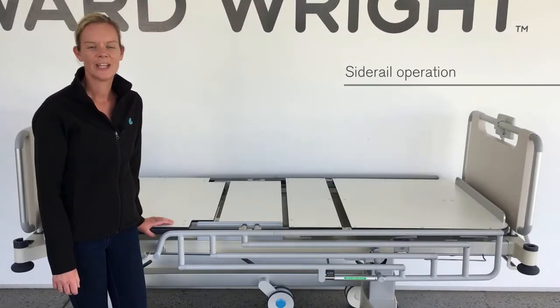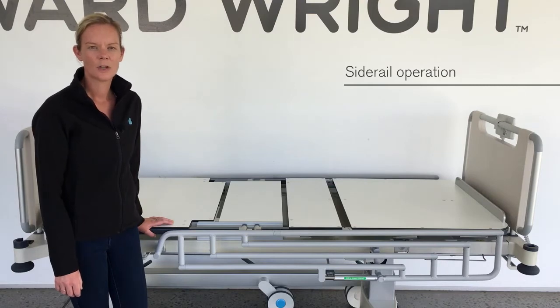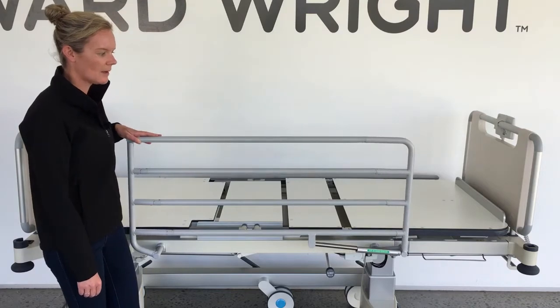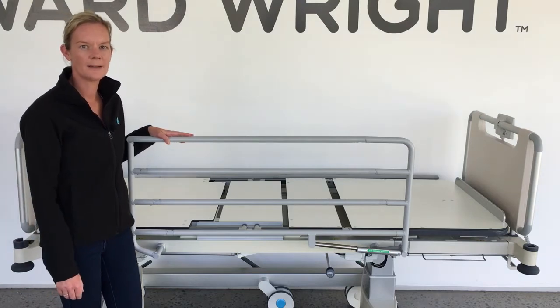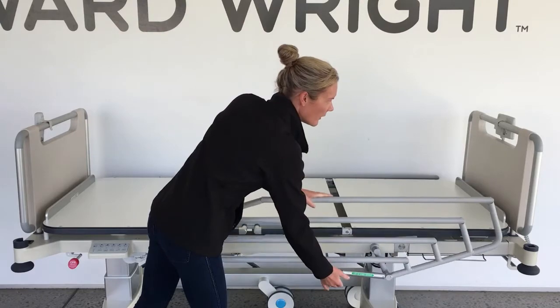Side rails are fitted to each side of the bed. To raise the side rail, simply hold the top rail and raise. The lever will automatically latch. To lower the side rail, hold the top rail with one hand, lift the release lever with the other, and push towards the foot end.